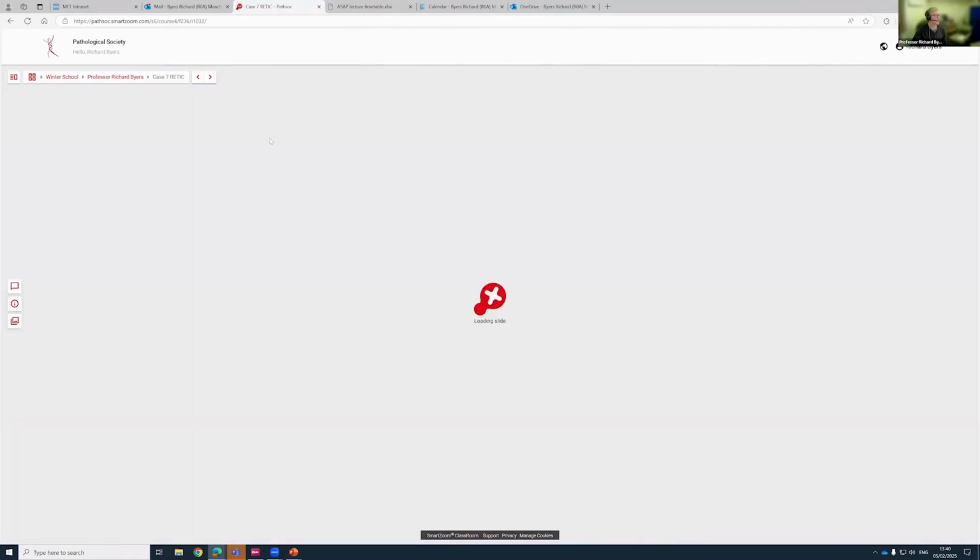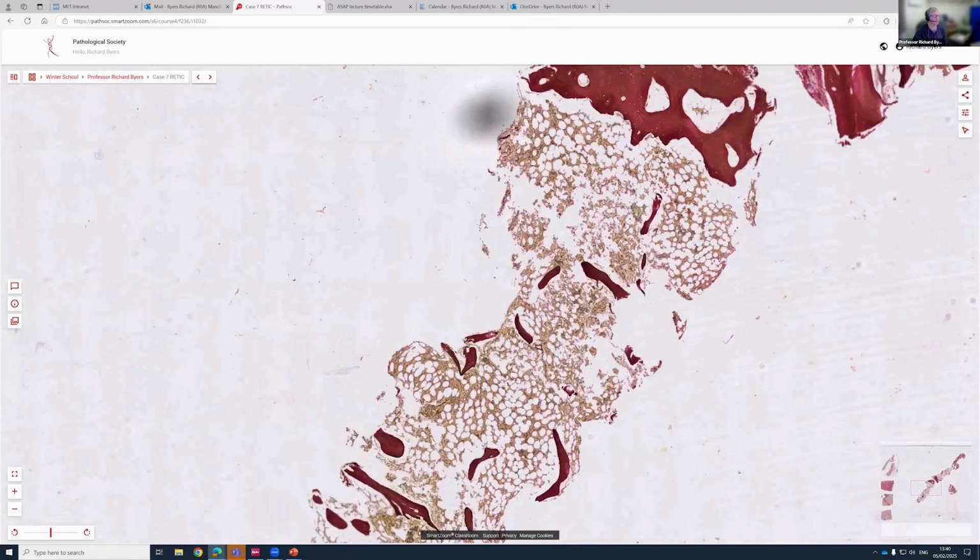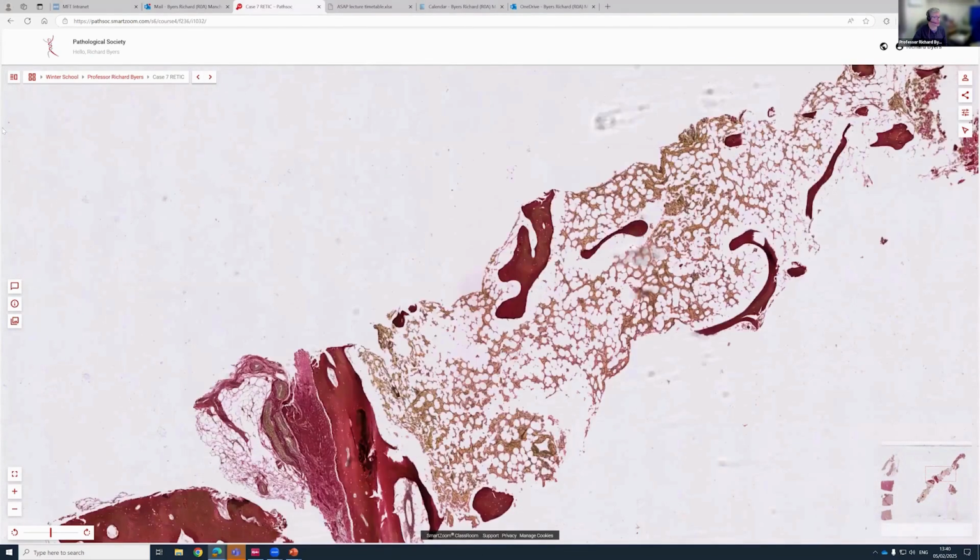So if we look at the CD61, the retic is not increased. And the cellularity is not increased. So that's important. In essential thrombocythemia, the cellularity and the retic are not increased. In polycythemia vera, where you get high hemoglobin, you can get increased megakaryocytes, but they tend to lie singly, and the marrow will be hypercellular in general, whereas in ET, the marrow is usually normocellular.